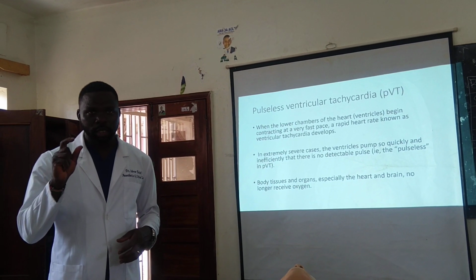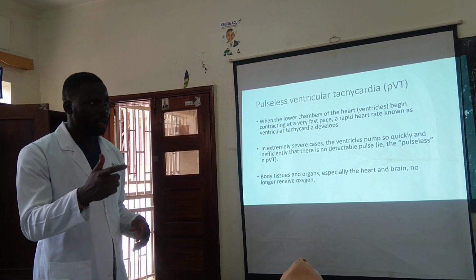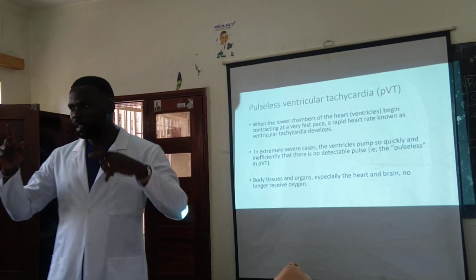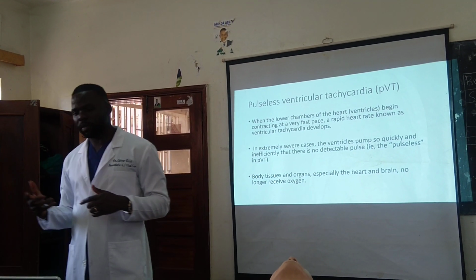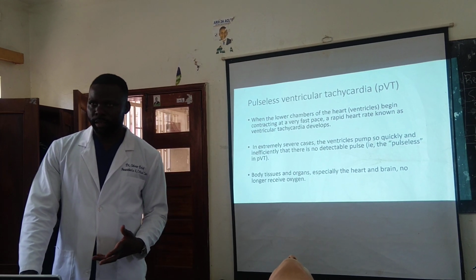But you're going to look at the actual wave on the monitor, how it looks, and how you can differentiate which one is this. How do I know? And I said you need to know the background. You need to have the background of what? Electrocardiogram analysis.